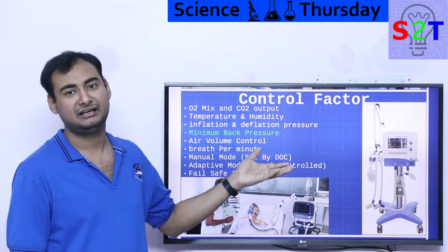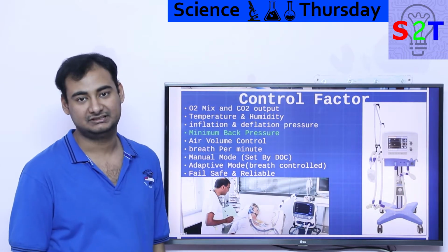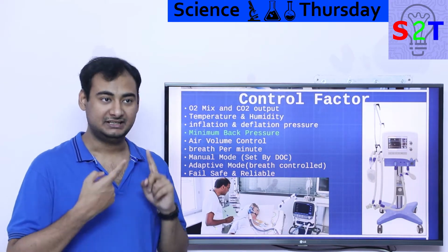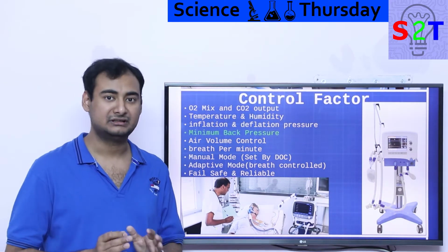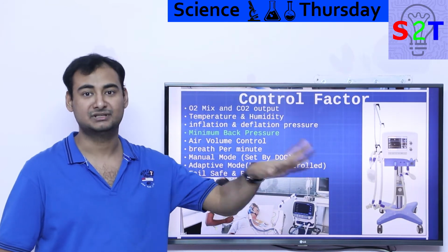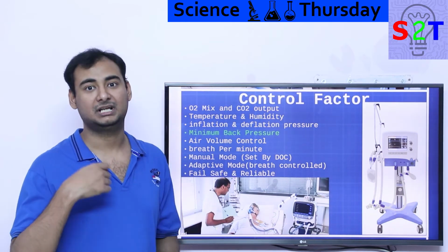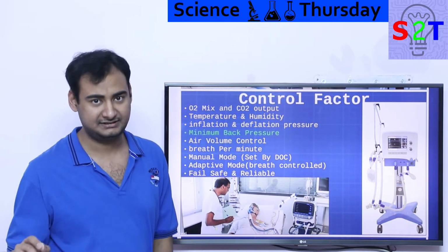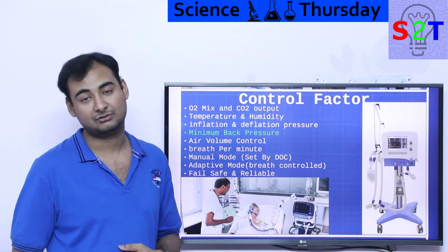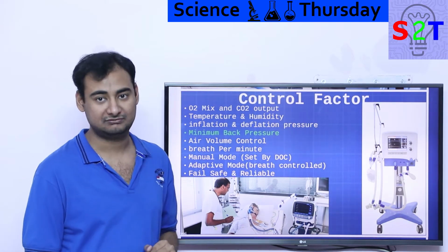And because it's a life-critical system and it has to work, it is classified as fail-safe with reliability. If anything happens, let's say a power spike, it must have an electrical system strong enough that, even if lightning falls on the wiring system, it must handle it. If you have a power outage, it must have either a battery backup or an alarm system or a passive fail-safe system, like, okay, I've stopped working, I'm not going to suffocate the person, I'm going to go into positive oxygen pressure or whatever, so a minimum fail-safe state is there. It has to do all of that.